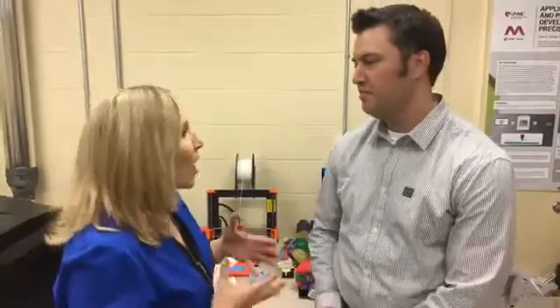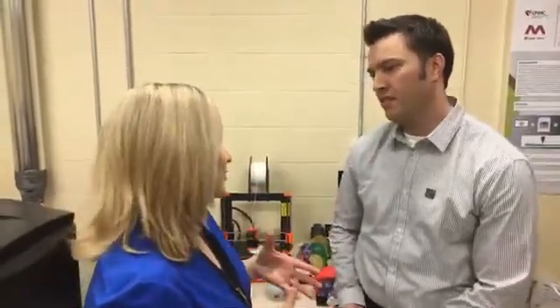So how are we using 3D printing at Children's to help us deliver the very best care for kids? Well, currently we're using it mostly for preoperative planning. We take CTs and MRIs, and we're able to take the information off those and create 3D models for our surgeons to prepare for surgery or to help educate patients and families on those surgeries that are going to happen. And educating residents probably as well.